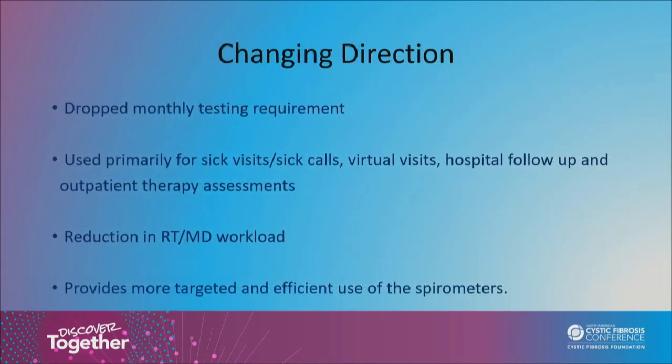So one of the things I thought about when I was putting this presentation together is, man, we really changed our program. We started out with this plan, it didn't go so well, and we had to change it. And really, the best thing that I took from it when I looked back is that the only thing we did is we dropped the monthly testing requirement.